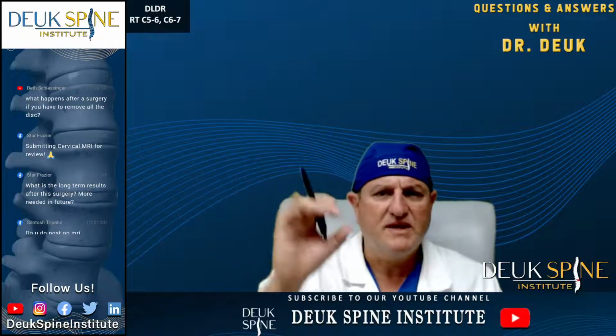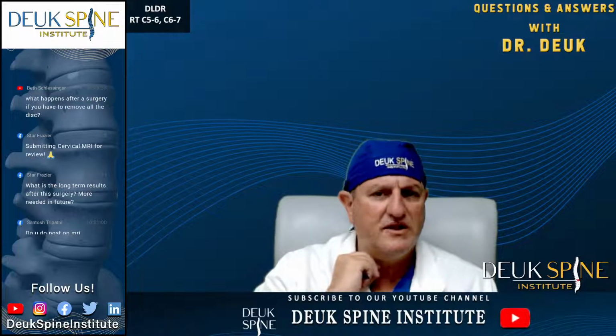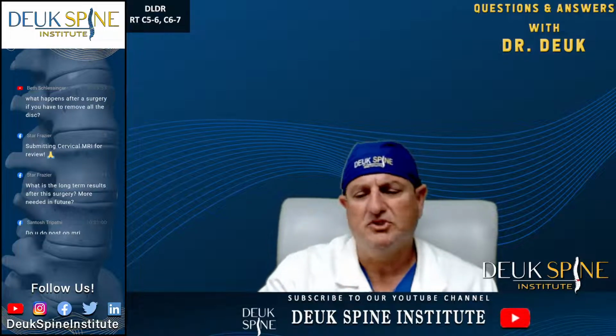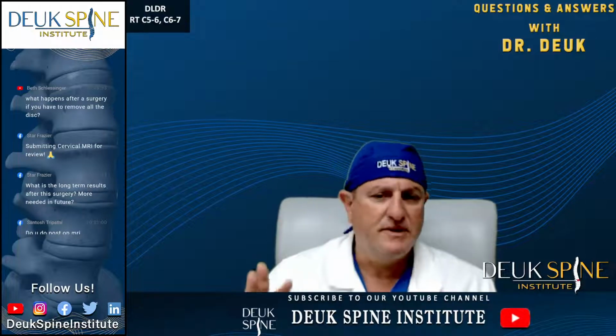And it all starts with endoscopic spine surgery done through the front with a tiny little cut like you saw, 4mm incision. What have I done different? Number one, I put people to sleep. Why?